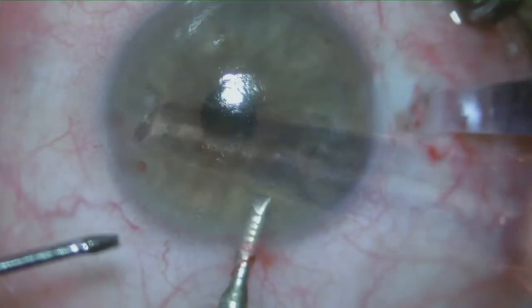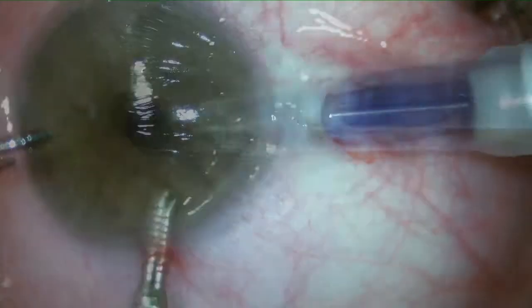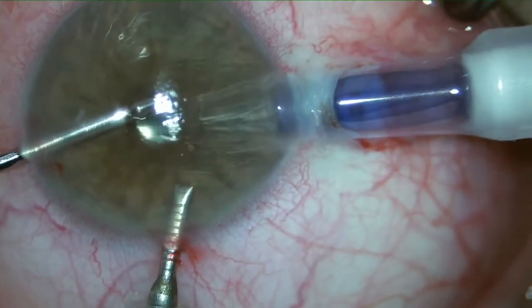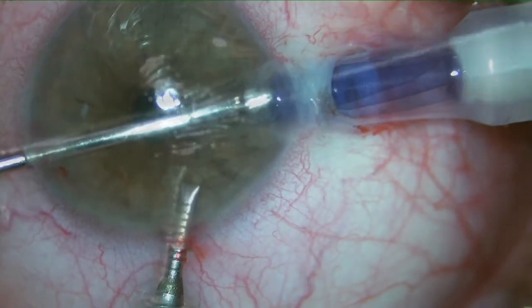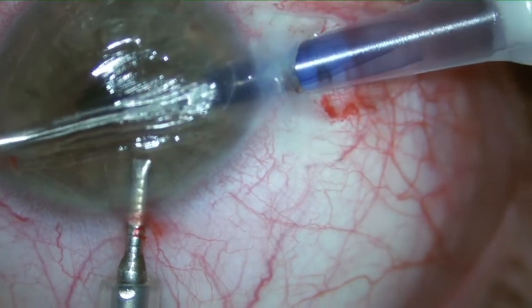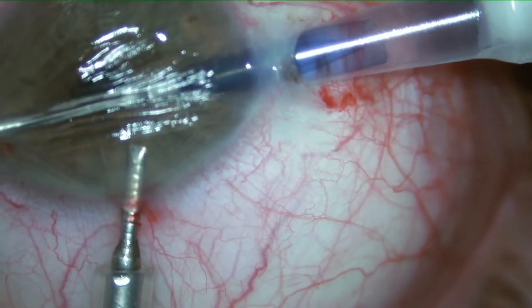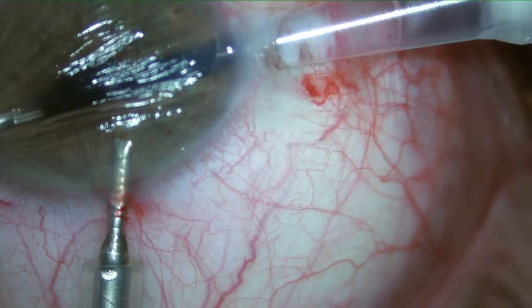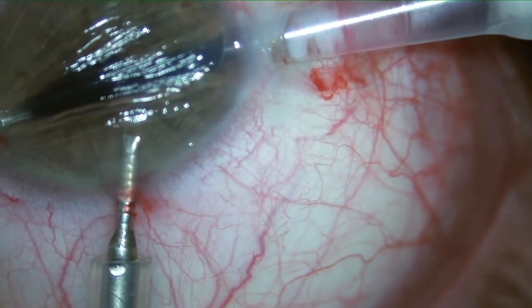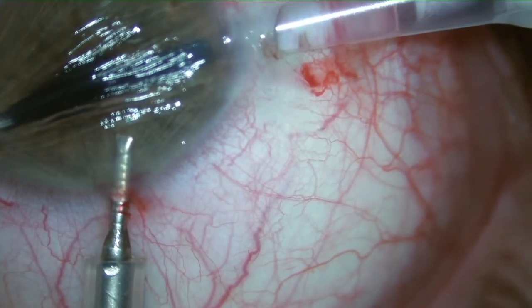The asymmetric mark identifies the correct orientation of the tissue and is used as a reference for grasping it. For sutureless DMEK, we deliver the preloaded tissue through a scleral tunnel under minimal irrigation from a dedicated anterior chamber maintainer with a side port. The tissue is grasped at its edge with dedicated forceps and is then slowly pulled out of the cartridge, which is finally removed from the anterior chamber.